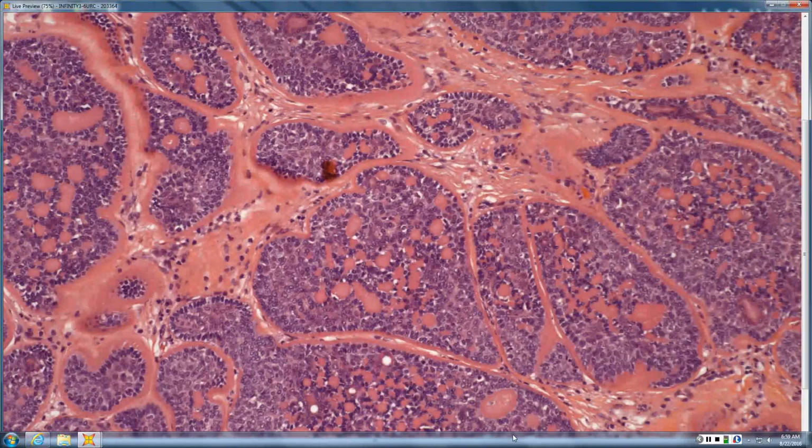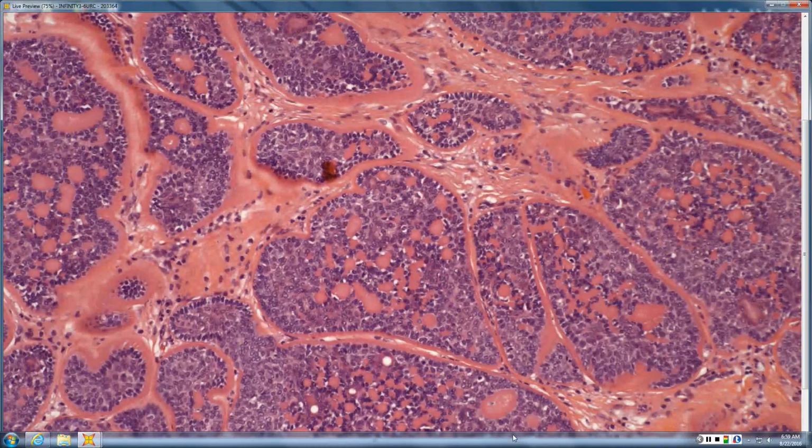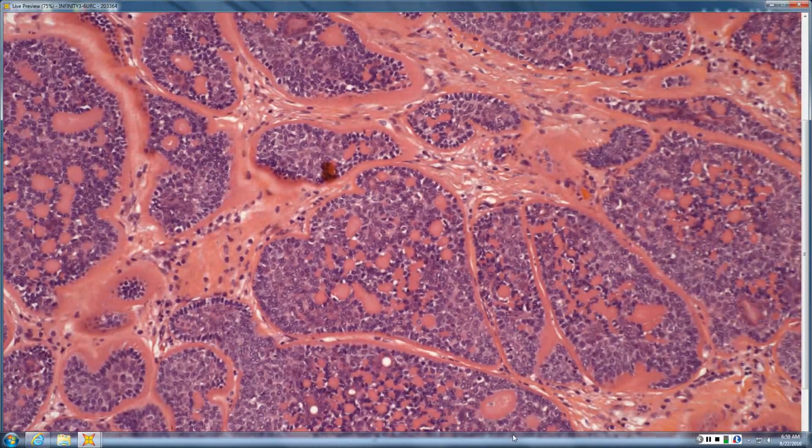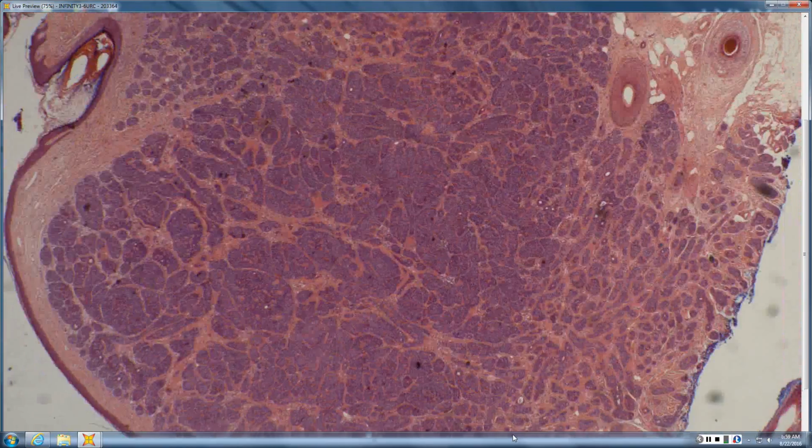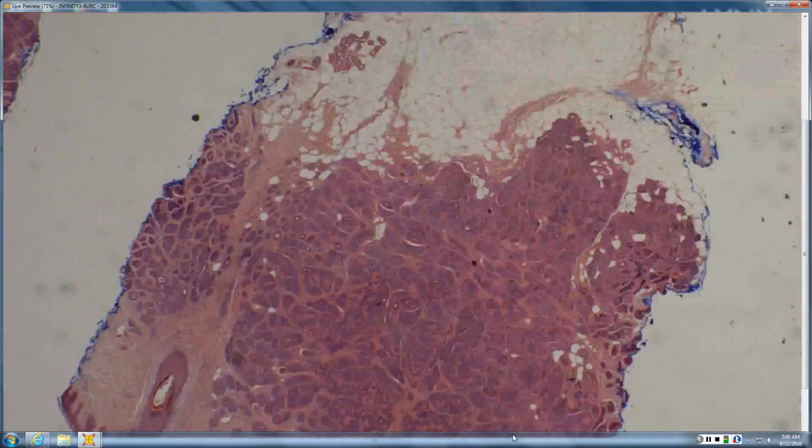And then you do see little duct formations, so little tiny ducts scattered throughout. But it's really that jigsaw puzzle that just kind of gives it away. Don't forget, Brooke-Spiegler, you also get the trichoepitheliomas and spiradenomas and cylindromas. For spiradenomas, I'll wait till we get to that one. So this classic jigsaw puzzle architecture is great for a cylindroma. Those are fun ones to get because they're so easy.